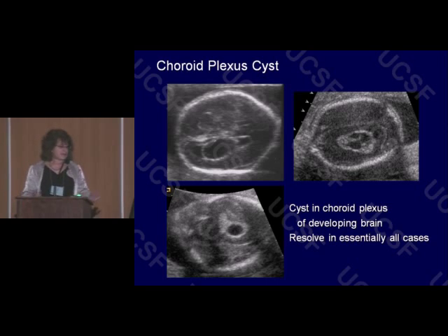Now, I want to talk about choroid plexus cysts largely because they are so much more common and really not much cause for concern, and we all play a part in how much concern is triggered among patients when this observation is made.